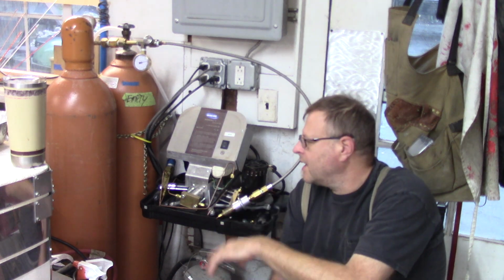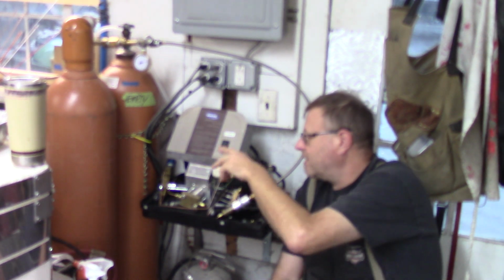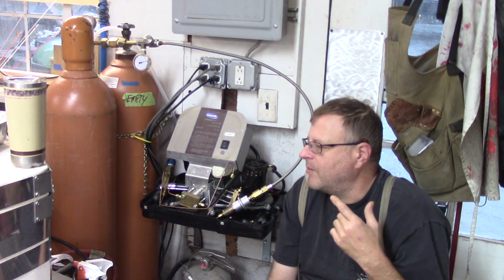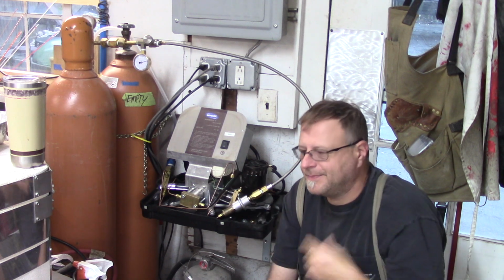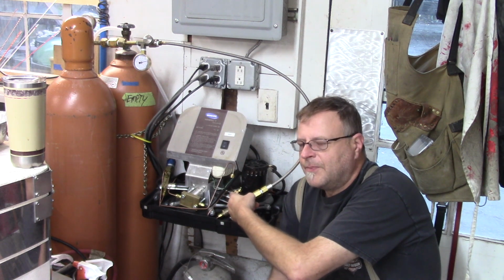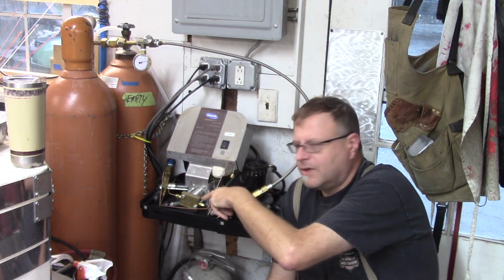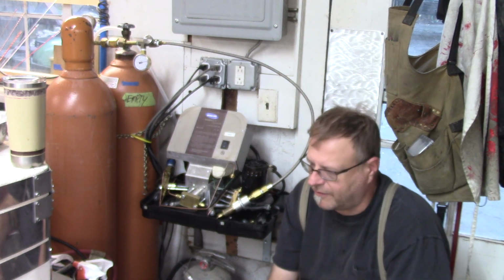It's really cool. I did not measure the bore cylinders of pistons 1, 2, and 3 because I didn't take those apart. I didn't take those apart because this thing actually still does work. But I did measure the cylinders, or the pistons and the bore cylinders of cylinders number 4 and 5. I'm just going to use very, very, very round numbers here. Cylinder number 4 is, and this is all imperial, 0.462, I think. Don't quote me. Don't go by that. Cylinder number 5 is like 0.261 or something like that. I wrote the numbers down. I don't have them right in front of me.